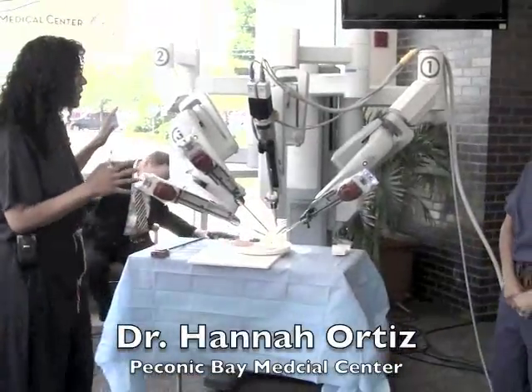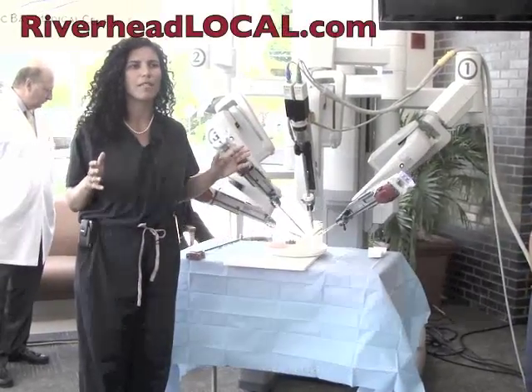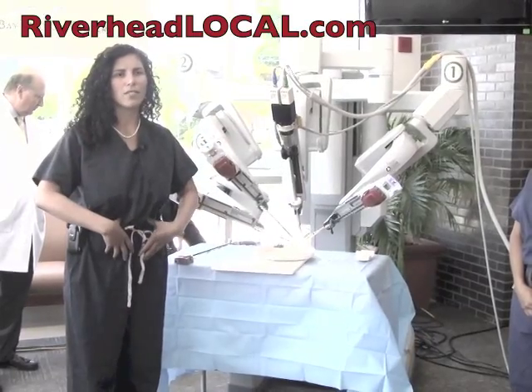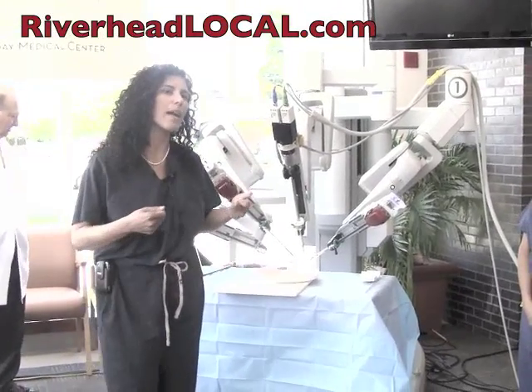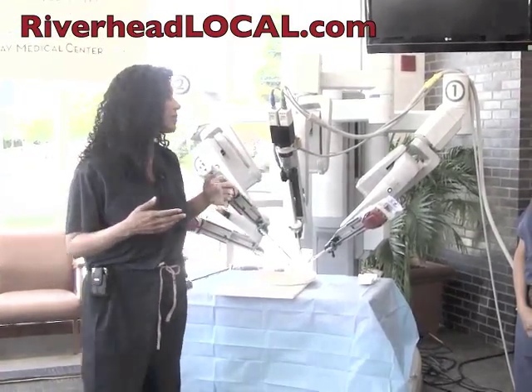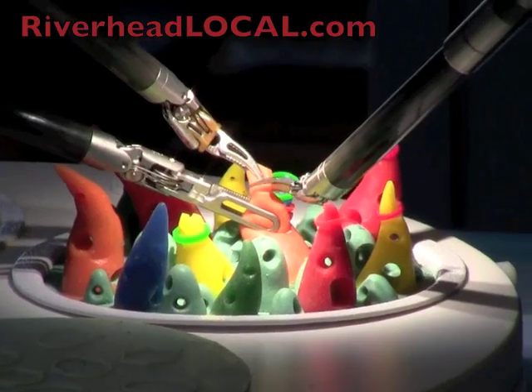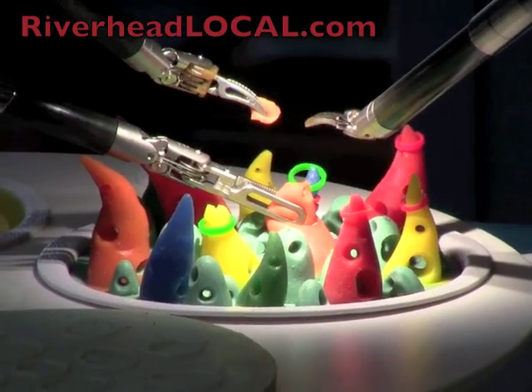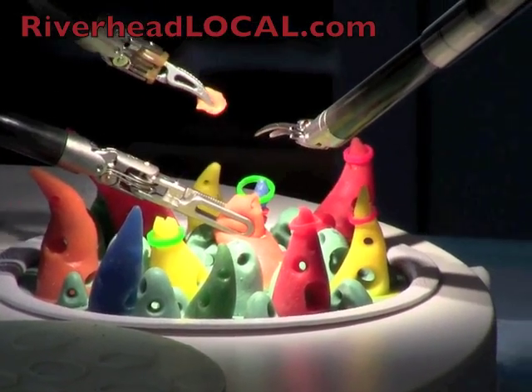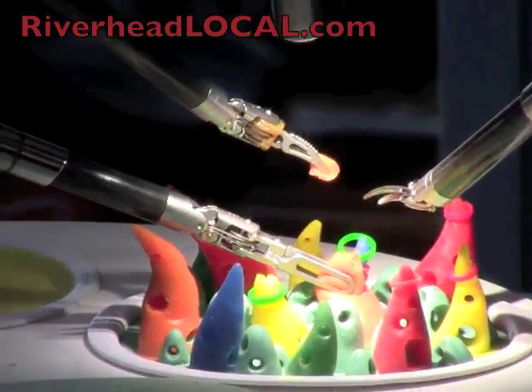Got the laparoscopic components. Many of us are familiar with laparoscopic surgery. Basically, it's surgery done through tiny incisions in the abdominal wall where little ports are placed, and then the instruments are long and skinny, and you move them around in the patient to do the operation. What the daVinci technology does is that it puts those laparoscopic arms in the hands of a robot that's going to correct for surgeon tremor, but also create much less movement around the port site where we place those instruments, so that the end result is less pain.